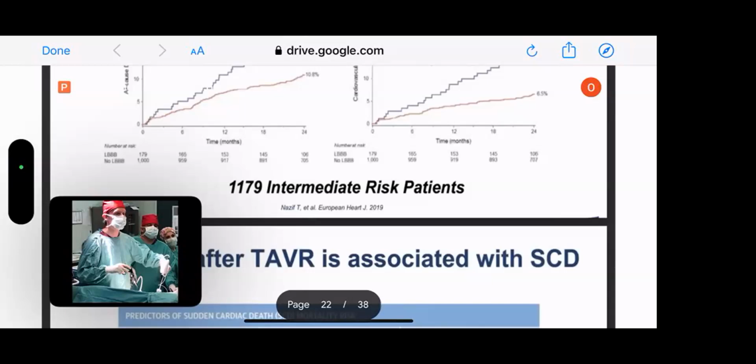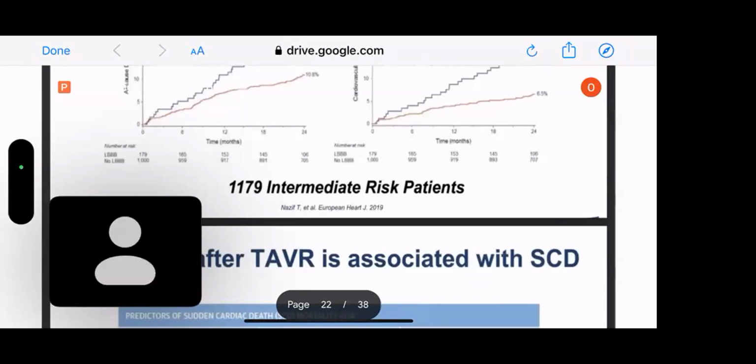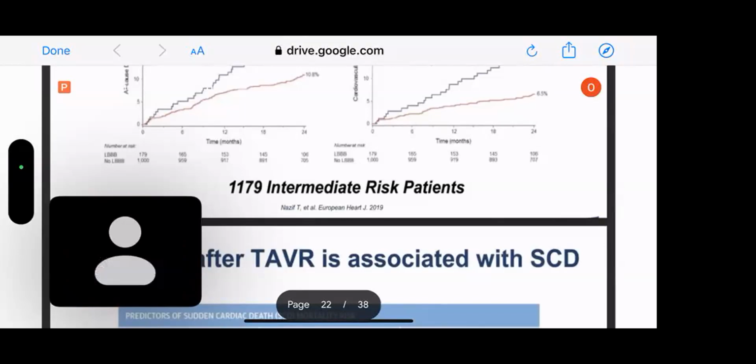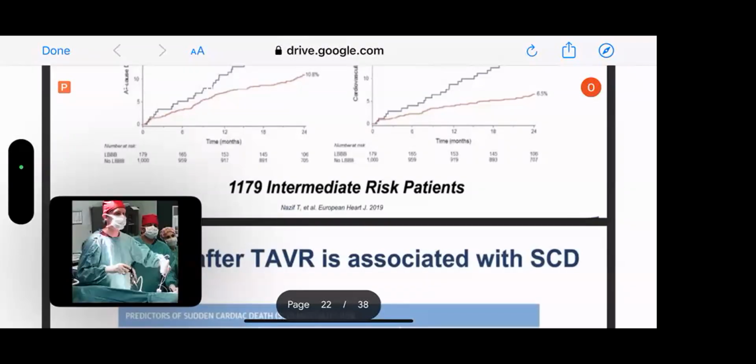On average, why would you implant a TAVI in a patient? Because usually the first point of call is a valve replacement, an open heart surgery. Or is it for those patients that are quite feeble and quite old, that proper surgery would be too much for them, so TAVI would be the best option for them?